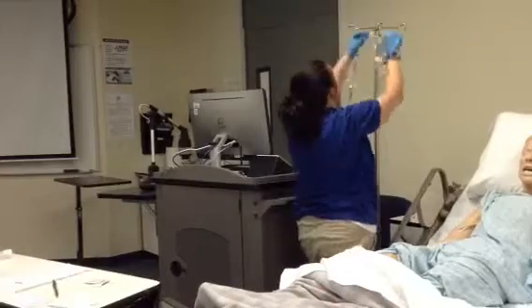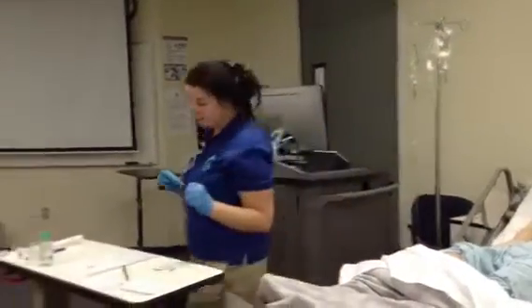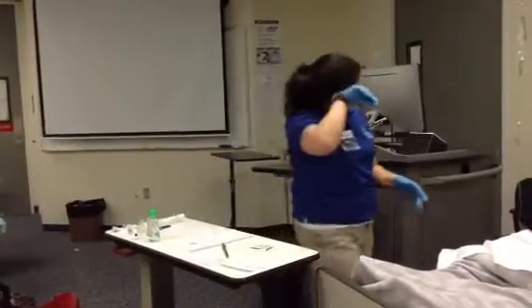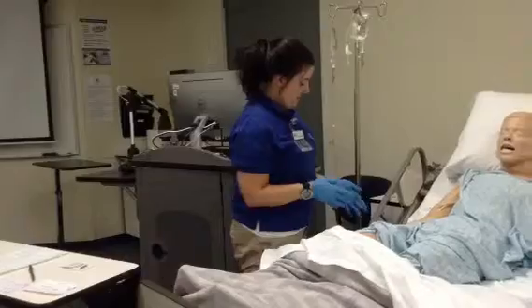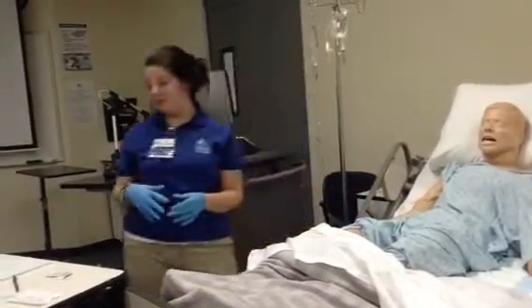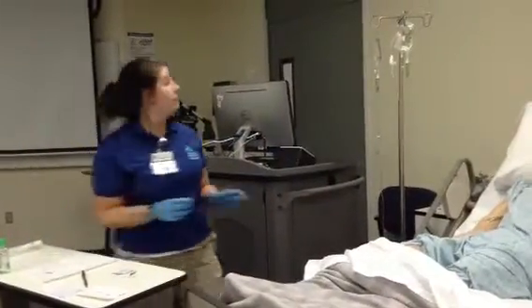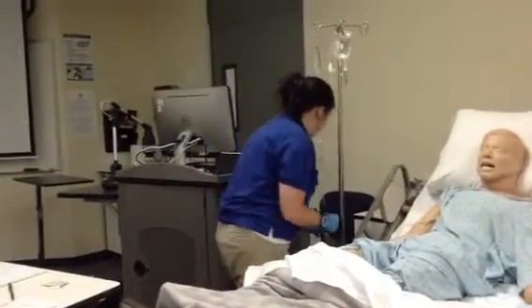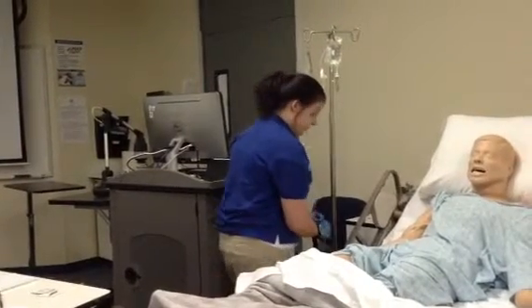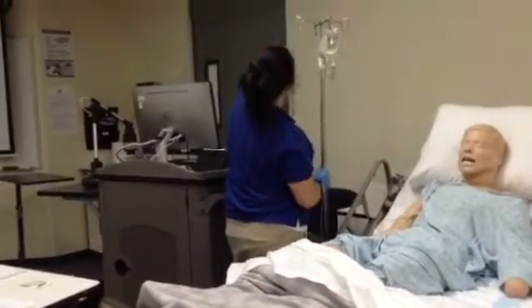There we go. Alright, so that's hanging and waiting. Okay, so now at this point, I'm going to check that primary IV again, make sure there's no infiltration, and we're good there. Okay, so now I'm going to go ahead and get ready to clamp off your primary vancomycin. So that's clamped. I'm going to go ahead and take it off.